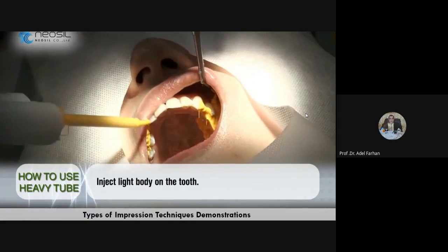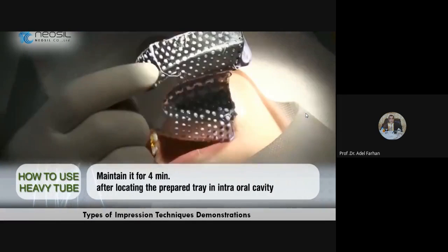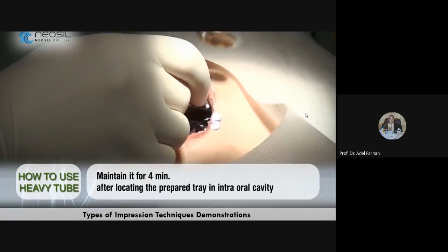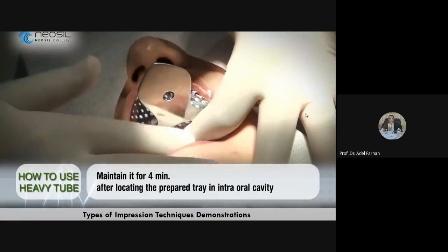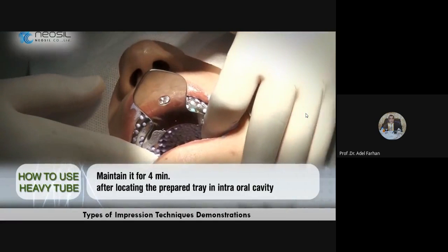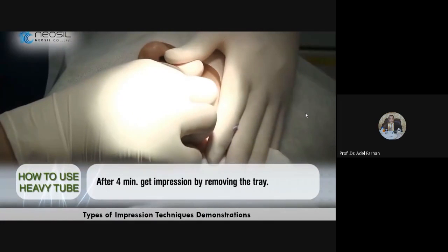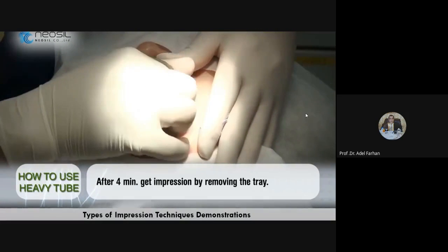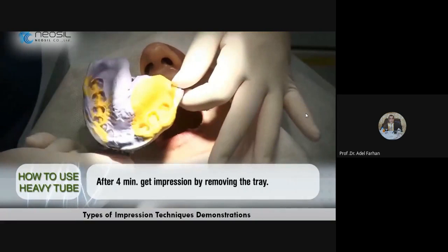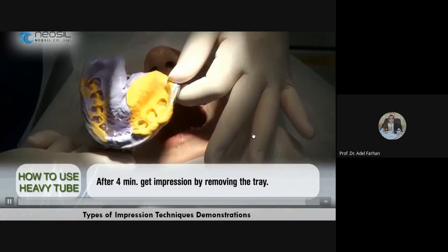Then the loaded tray will be seated over the light مثل ما نشوف. طبعا مثل ما نشوف هنا بنستعمل ستوك تري، لازم اذا تستعملها يكون السايز مالتها قريب جدا من المريض، والا اذا كانت اكبر تسوي لنا دايمنشنال تشينج عالي. مثل ما نشوف الان هذه الامبريشن طلعت.